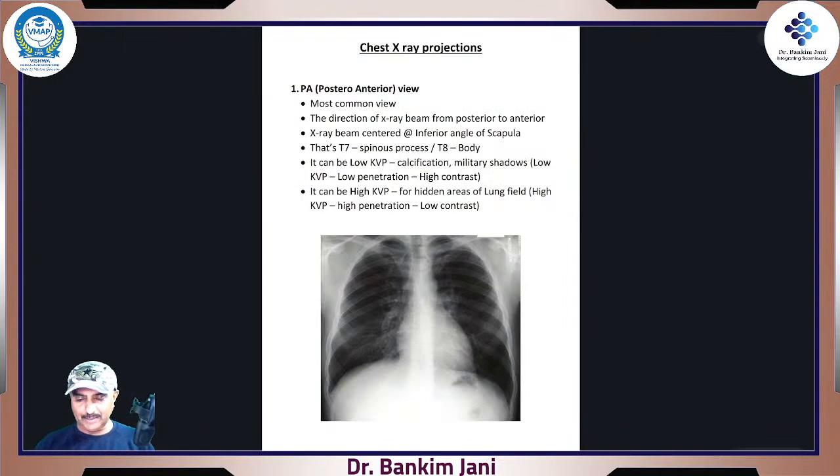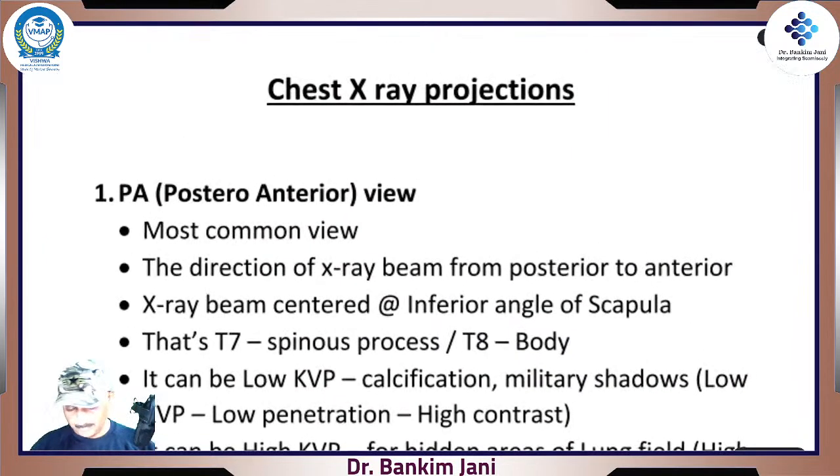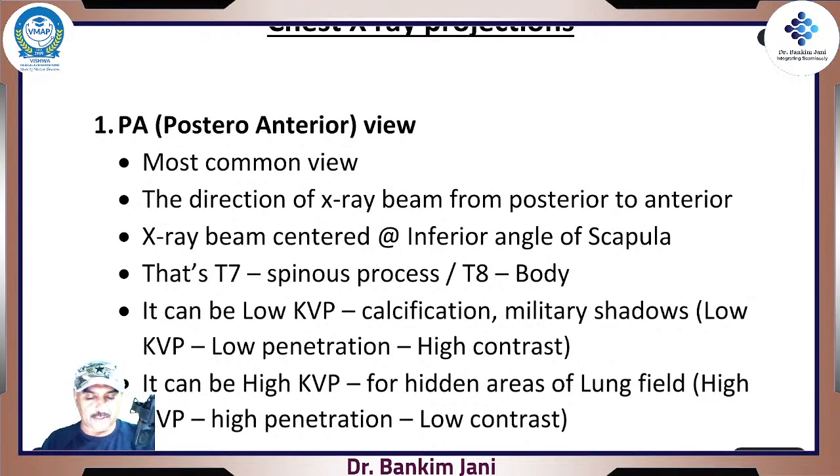And for that, what I have done is I have kept almost most of the things crisp and clean, ready for you. The same thing, I'll send it to you so that we can discuss more. We have to write less and we can discuss more. So this is X-ray chest projections. Projections means the various types of X-rays, and this is with all those examples. The commonest one is the PA view, posteroanterior view. Most common. You know this now, the direction of the beam goes from posterior to anterior.